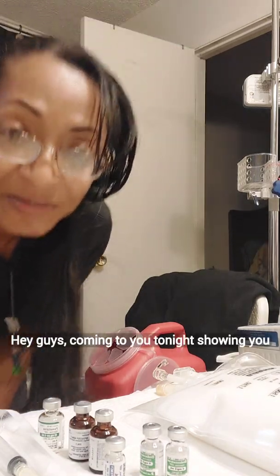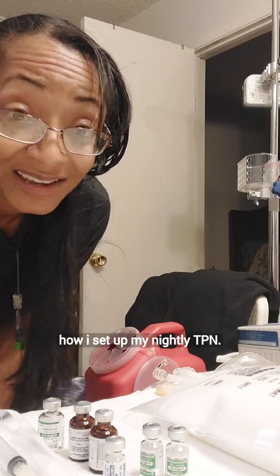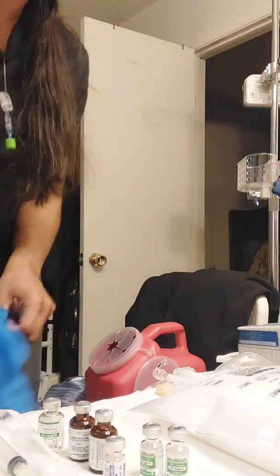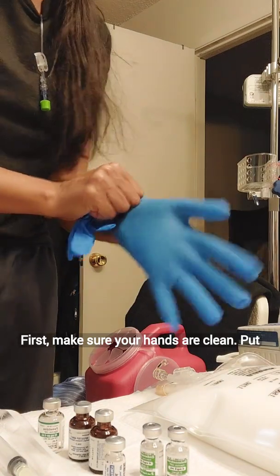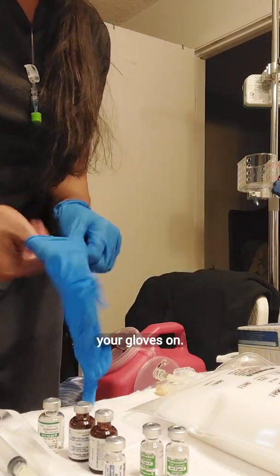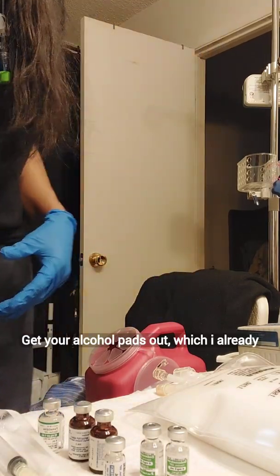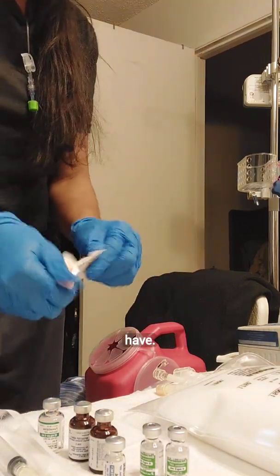Hey guys, coming to you tonight showing you how I set up my nightly TPN. First, make sure your hands are clean, put your gloves on, and get your alcohol pads out, which I already have.